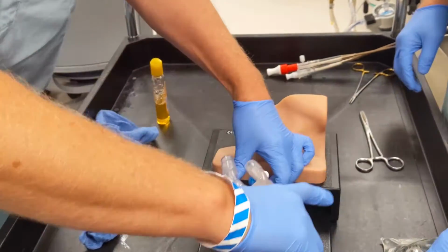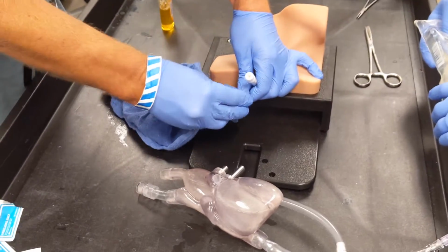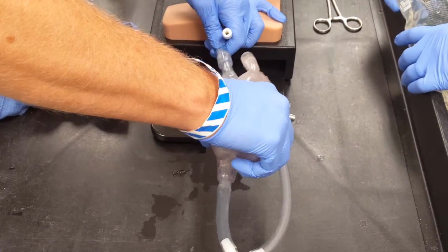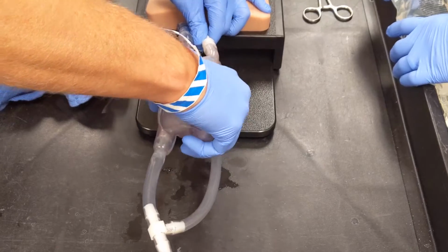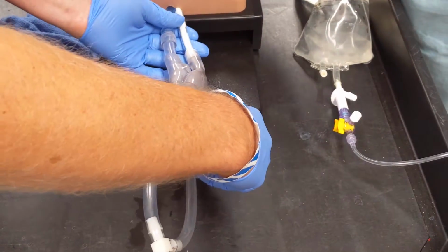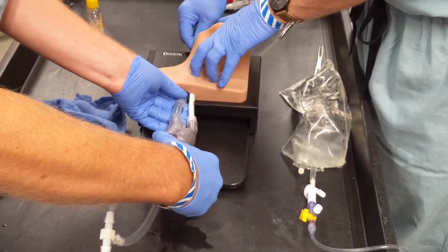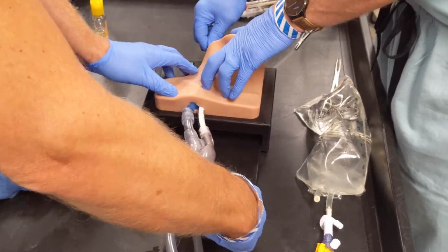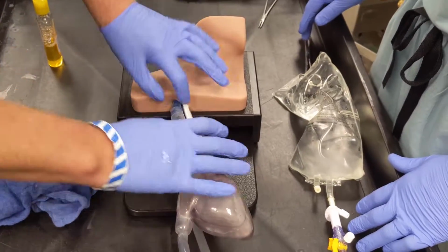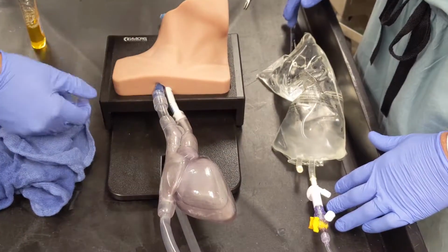So the heart, we can just push. It's good to wipe the soap off if you got soap on it. Basically, just push it in like that. Okay, and then there's 2 prongs here that match here. And you need an assistant to just pull the vessels gently. And you just work it into the neck where it matches, and then you just kind of gently work it, and then make sure they're still connected at the seam. Push it in, and you're set.